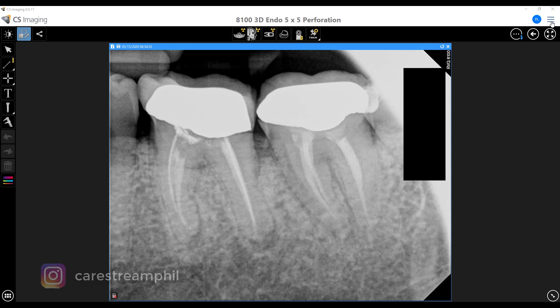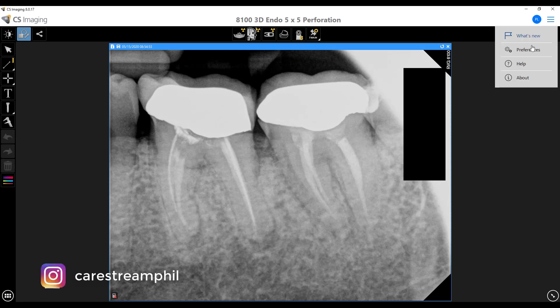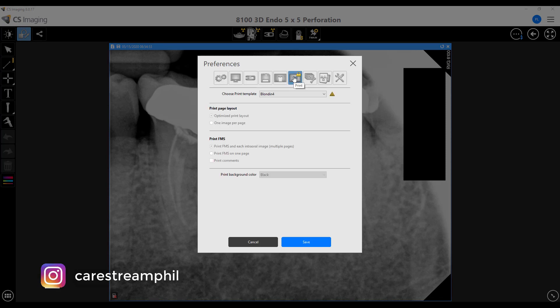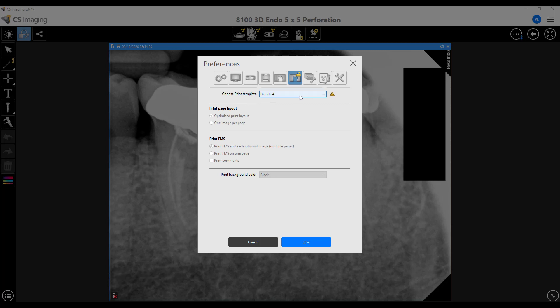So in the preferences in CSI 8, I can select the option that's right here, which is going to be for printing. And then in your print template, this is going to be for printing from your PAs or internal camera images or anything that's stored in CSI 8.